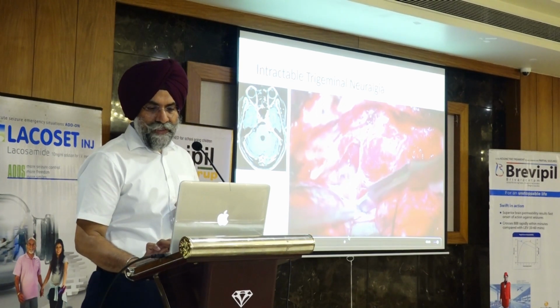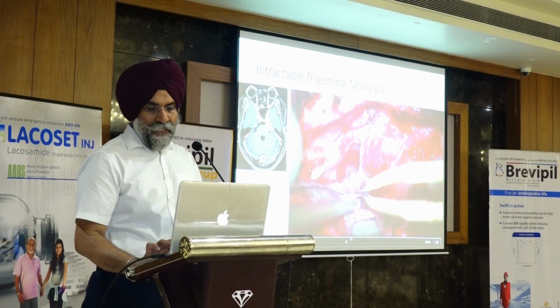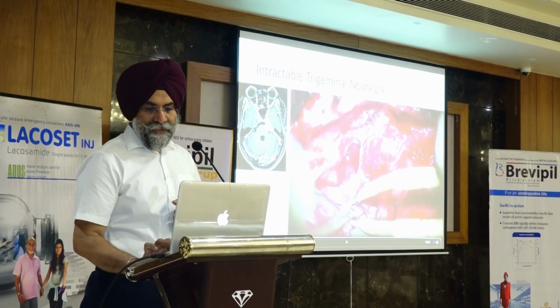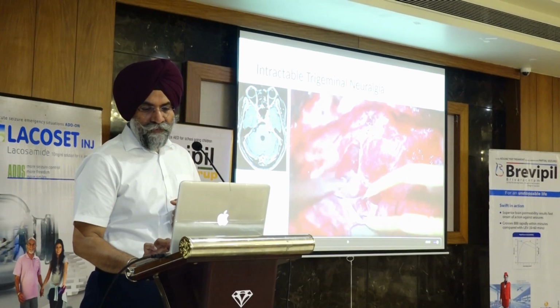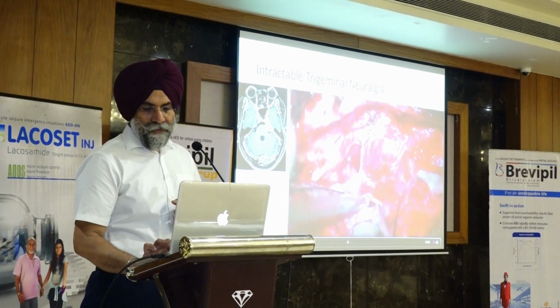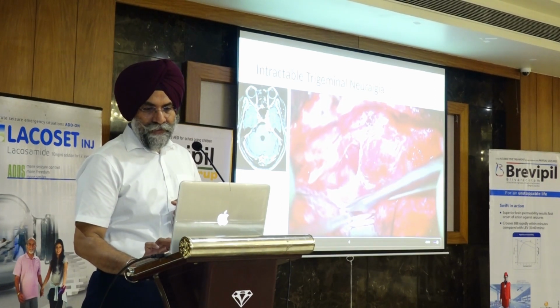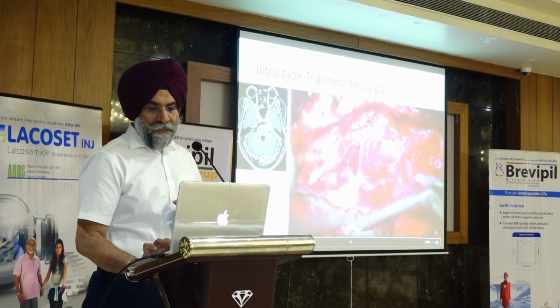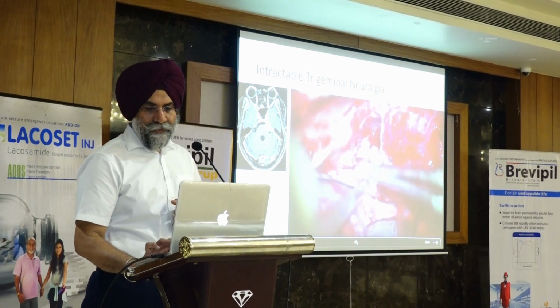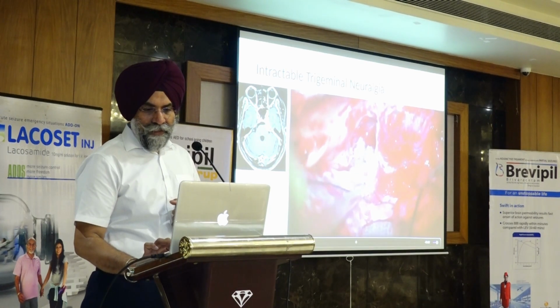Now we are just cutting the base of the temporal dura and entering into the intradural compartment, and then cutting the tentorium from lateral to medial side. So this is the lateral edge of the tentorium. We will be cutting, this is the floor of the temporal fossa, a very small incision here. So now you see this is all the posterior part of the cavernous sinus. V3 division, this is the V2 division fibers. So the tentorium is cut from lateral to medial.